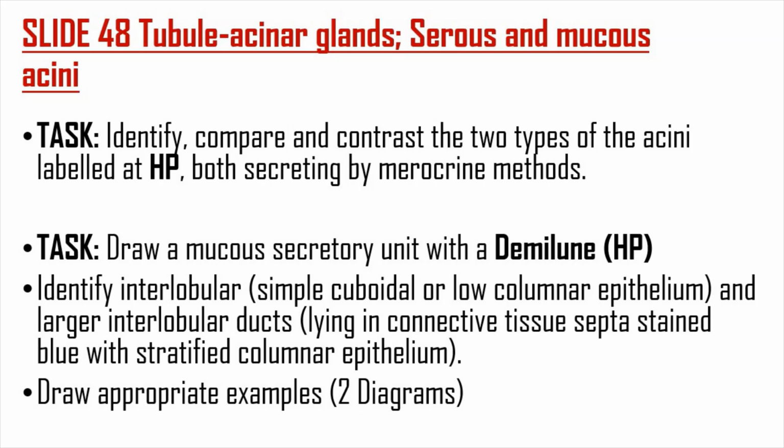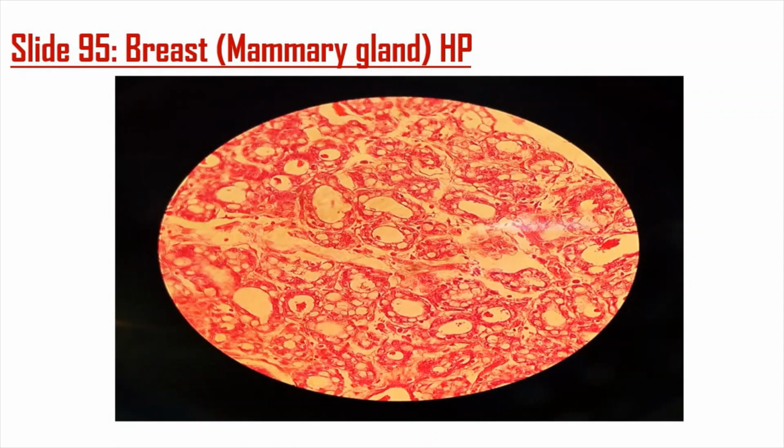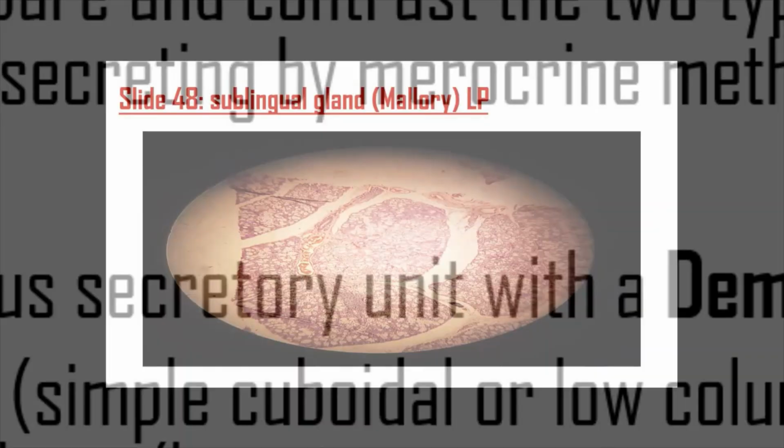Identify intralobular ducts and larger interlobular ducts. So we were just talking about it. It's in the breast. This is what this slide is talking about.